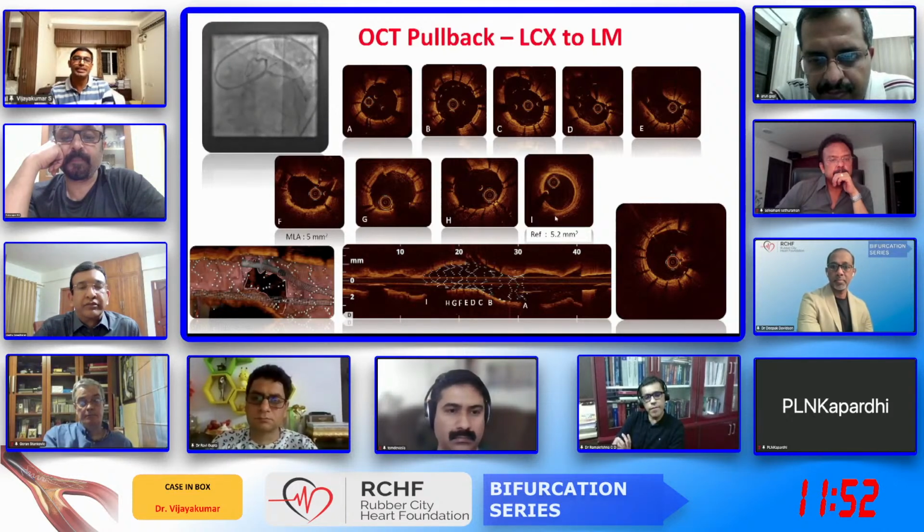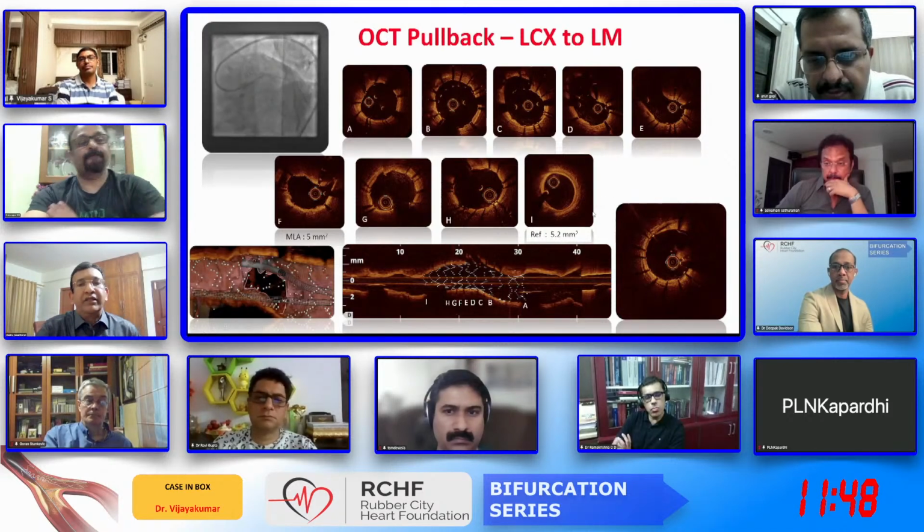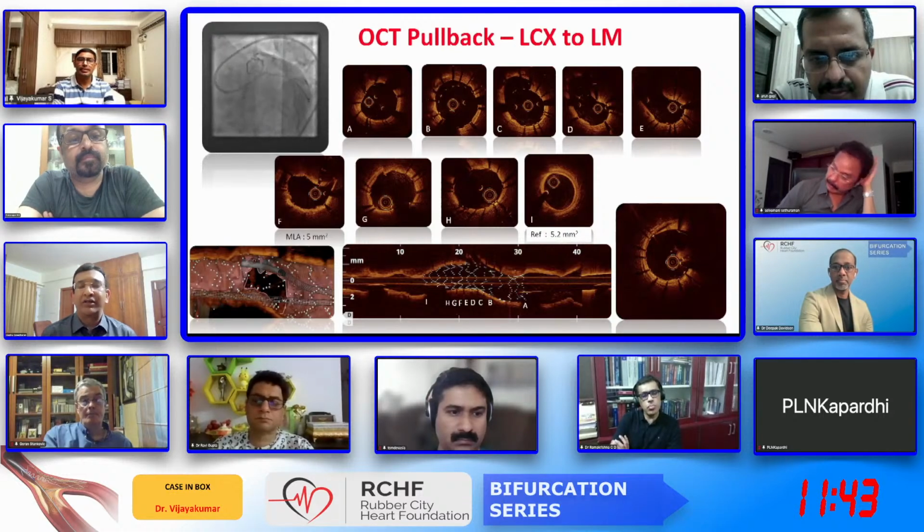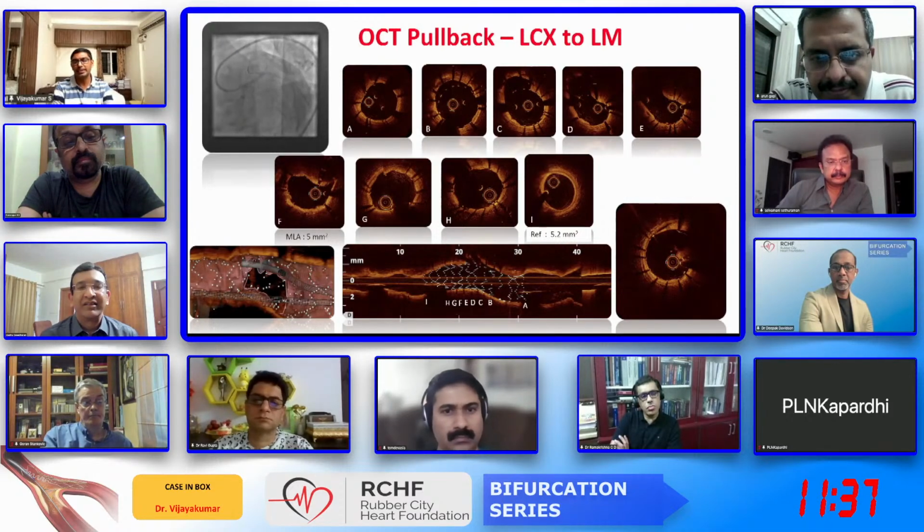So I'm done with LCX. So we are just going with an LAD. Any comments? Vijay, the nodule part is still compressed now. So would you do a DK culotte, or would you just go ahead with the regular culotte? Yeah, it is again a DK culotte, but this ostial part of the LCX is, as per the criteria, expanded. Any comments? What is the MSA there?